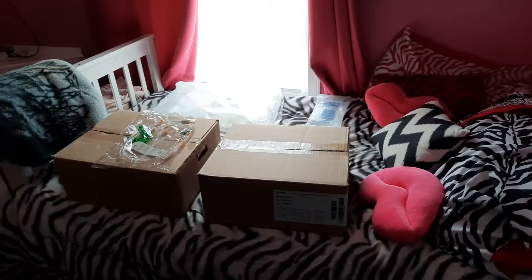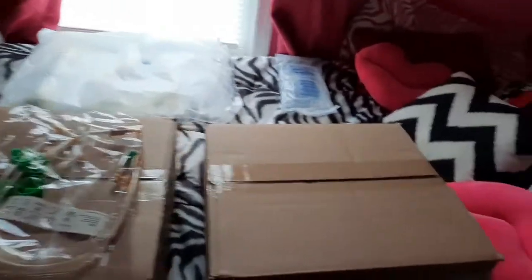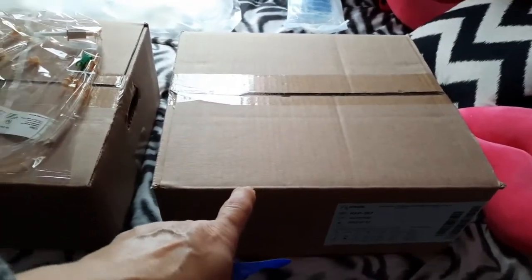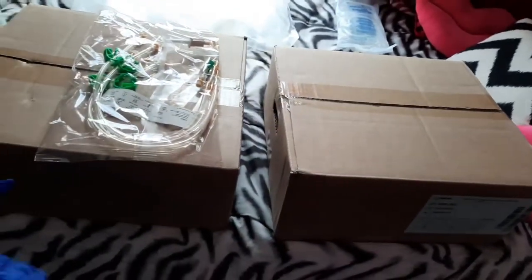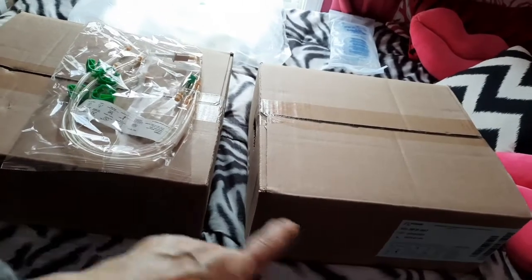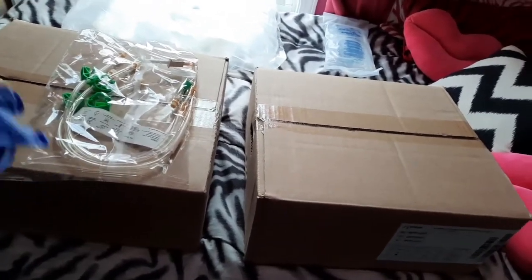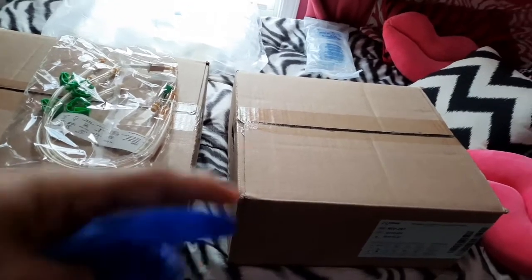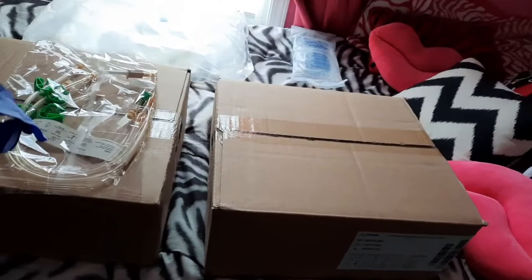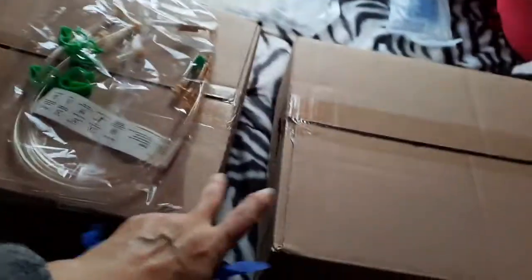All right, so let me show you what we have here. We have two boxes of dialysate. There's two 5-liter bags of dialysate in each. My prescription calls for 4, which is 20 liters. If each bag is 5 liters, 4 times 5 is 20. Everybody's prescription is different, but that's mine.